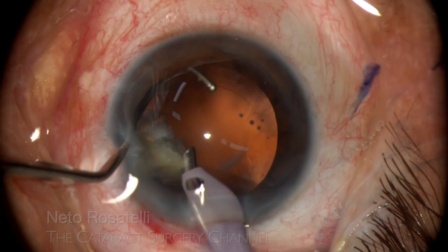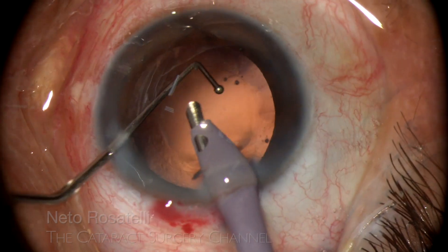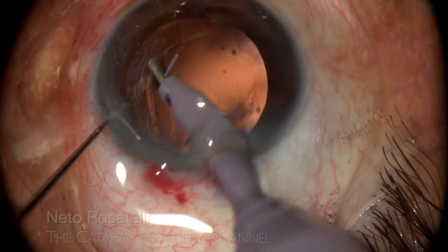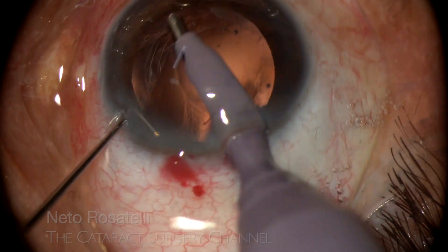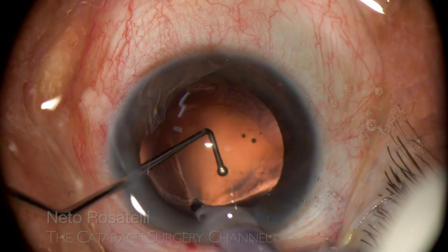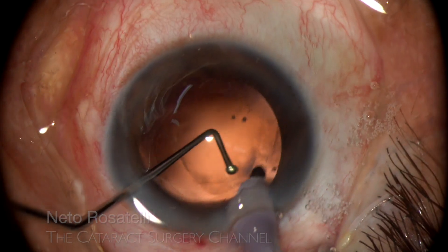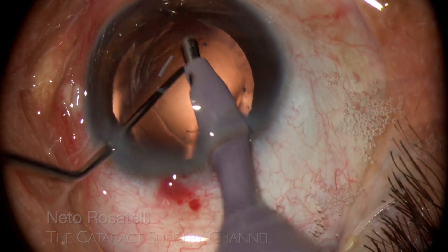The last and most dangerous fragment is taken with care, the chopper assisting in protecting the capsule. These cases often need a lot of posterior capsule polishing, and that's what I am doing now with the phaco tip. I go all around and clean as much as I can safely do.